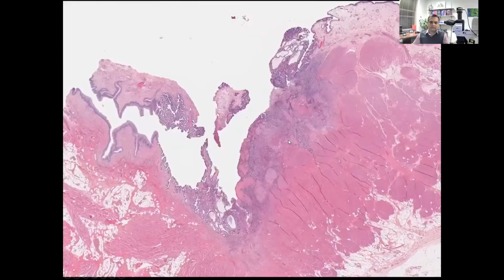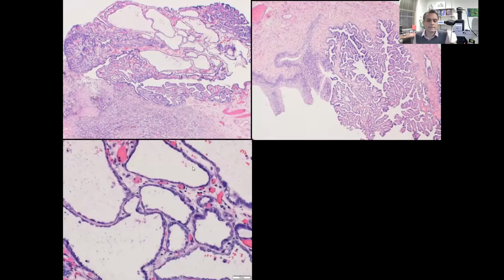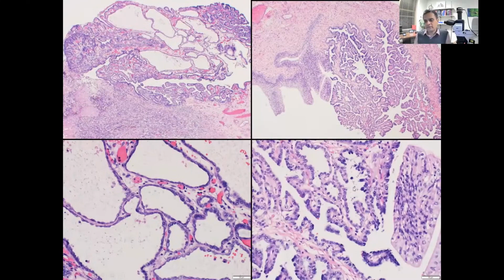This case, though, is somewhat unusual because here is the cystectomy specimen, and you can see the tumor over here, normal urothelium. So let's focus on these two areas. So this area basically shows the cyst-like elements that we saw, right, and the small gland-like elements, and the other one basically shows these papillary structures. So if you look closely at these areas, the cyst-like elements are lined by relatively bland cells that kind of look like endothelium, and there are areas where it also shows some hobnailing. And the same with the papillary-like areas, some cyst-like structures, some small papillary finger-like structures, and some hobnailing.